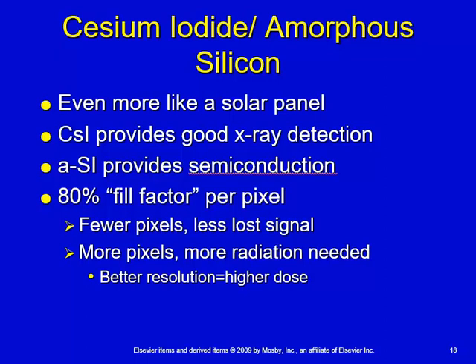If you look on page 300 and 301, you'll see figures 16-10, 16-11. I'll be referring to those, even 16-9, 16-10, 16-11. So what you've got in these individual signal detectors is an area that is capable of picking up the signal. And that would be your pixel detector.